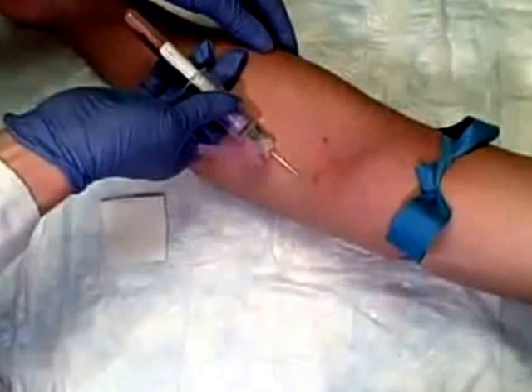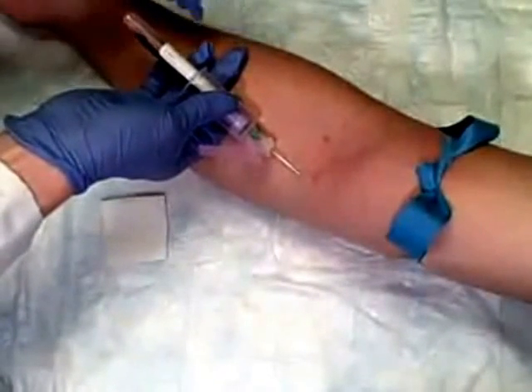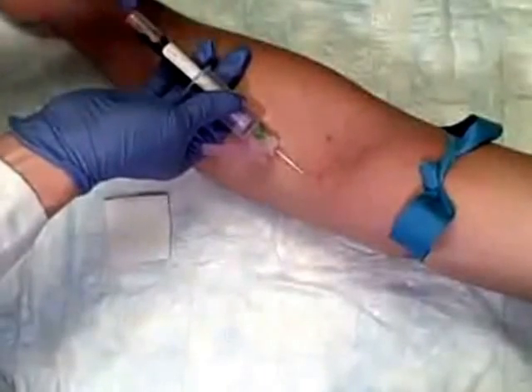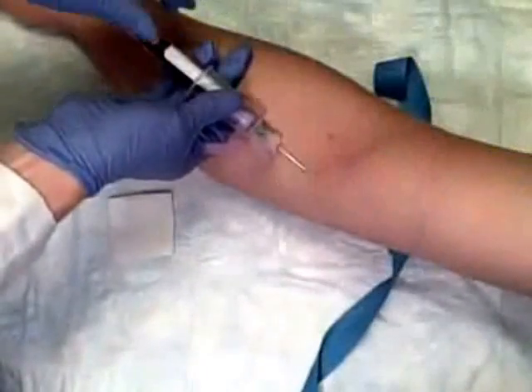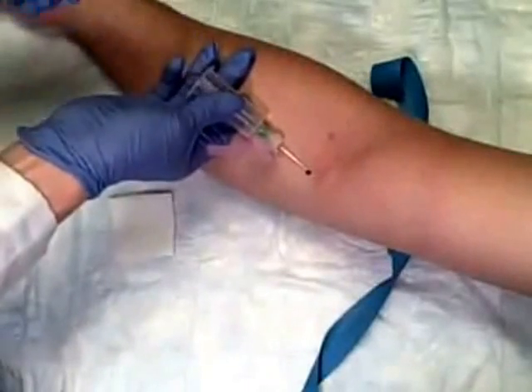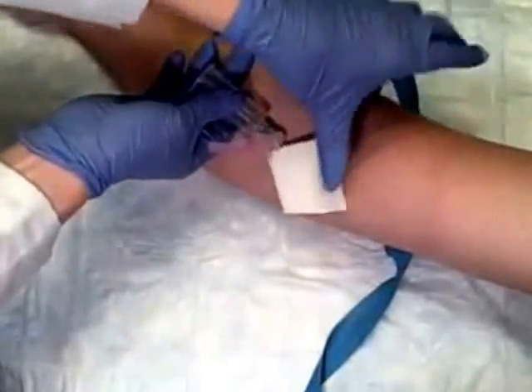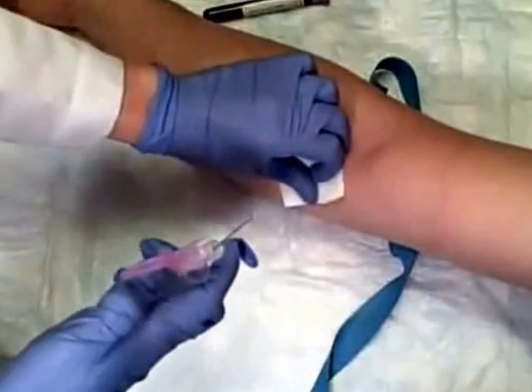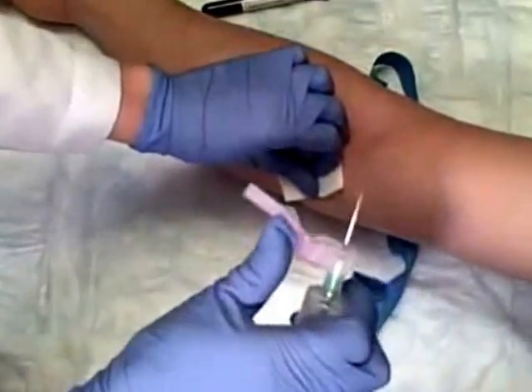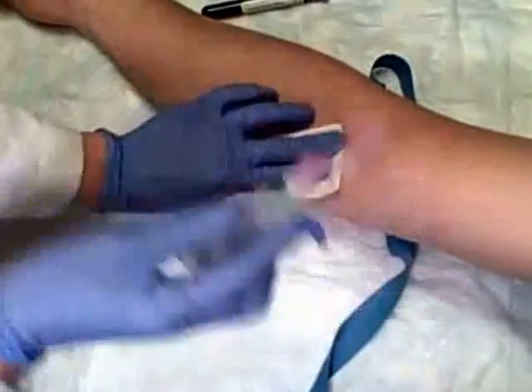We want to fill about three quarters to the entire tube. If we had additional vacutainer tubes, we could pop them on, but we do not. I'm going to remove the tourniquet now and pop the vacutainer off, invert the tube, and pull the needle out while applying pressure to stop the bleeding. This is a retraction needle, so we clamp it and place it in the sharps.